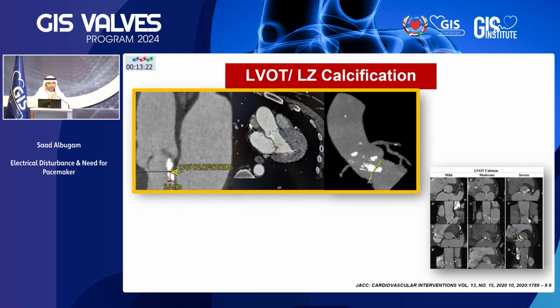The patient was evaluated for possible TAVR. A CT scan was done, and this showed significant calcification in the LVOT. This is passed as a moderate calcification involving the LVOT, and there is a grading system. This should be a talk for another day.